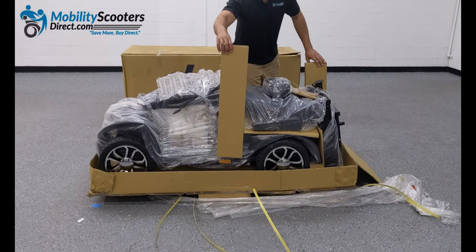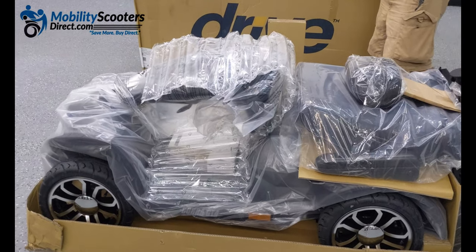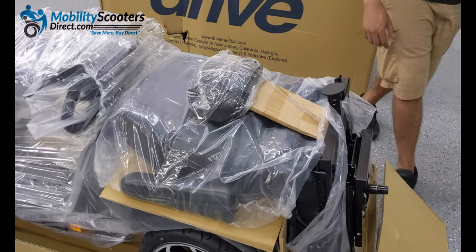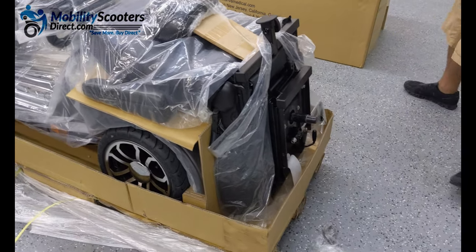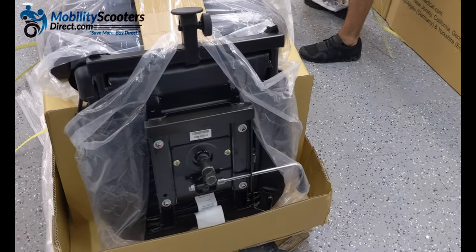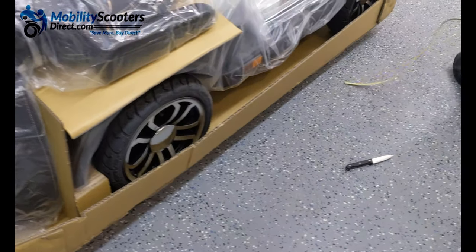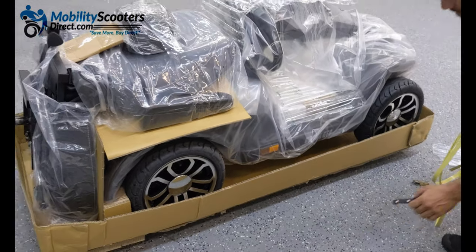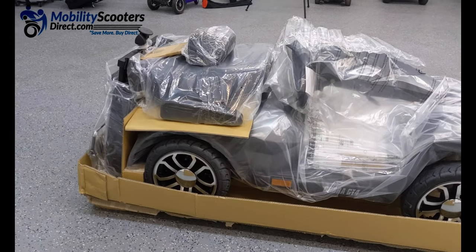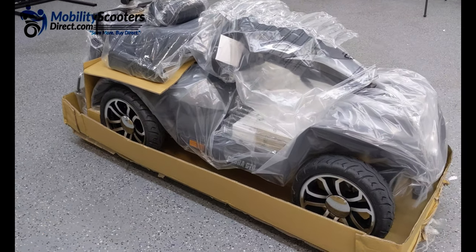Once you remove the top part of the box, you can begin to remove any loose pieces of cardboard that are placed around the side of the scooter. Everything is packaged tightly and neatly so that it's delivered safely during transit. Simply make some room, clear the cut pallet straps and the clear plastic wrap, pull it out of the way and put it to the side so that you can begin unboxing the rest of the scooter.